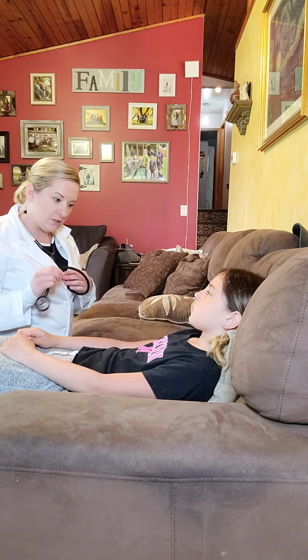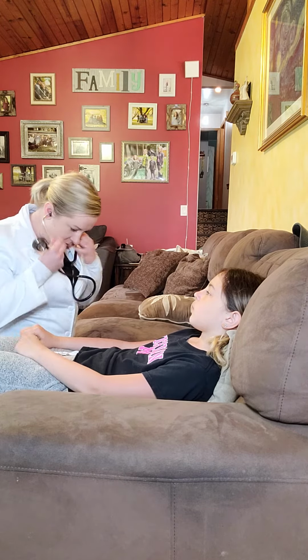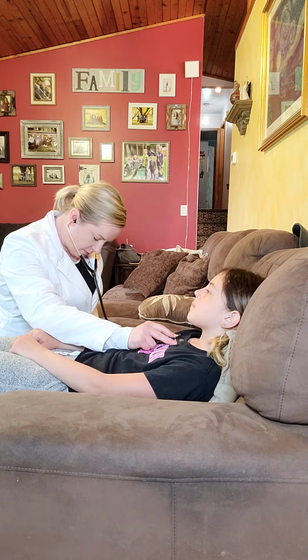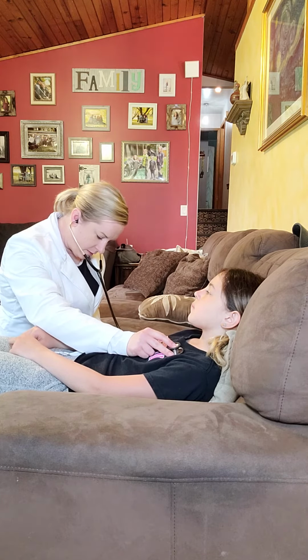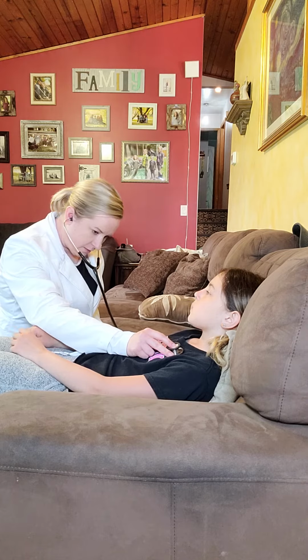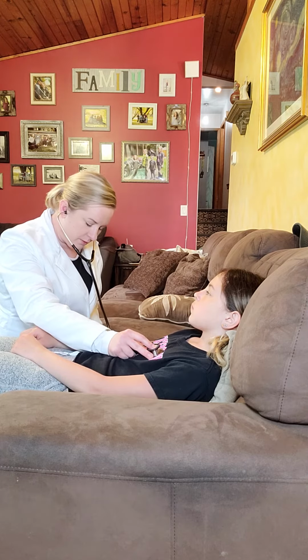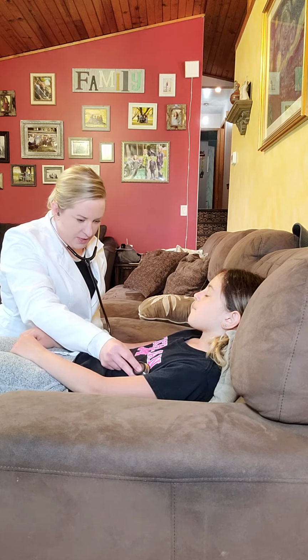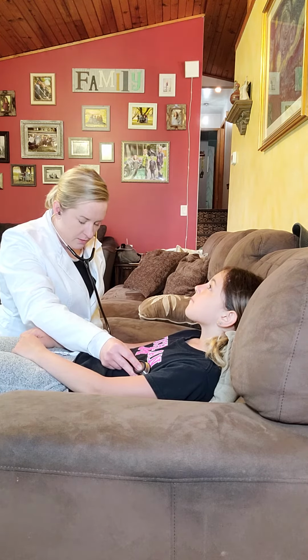So now I'm going to listen to your heart, okay? I'm going to listen to your heart in 6 different spaces. All right, so first is going to be the aortic area. And then the pulmonic. And then at the 3rd, 4th, 5th intercostals, and then down here at the apex. Good, just keep breathing normally.